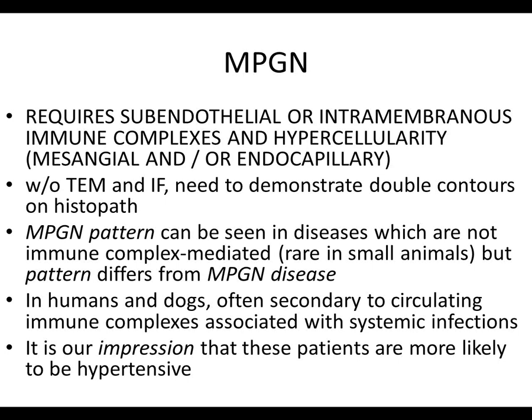And then I kind of make a comment, and I want to spend the last 2 minutes on this concept of a pattern versus a disease. Nephropathology is probably taking the same route that dermatopathology has done in the past, where we talk about patterns of disease. Usually that's a histologic pattern. So having hypercellularity, having some thickened glomerular basement membrane can actually be seen in a couple of diseases that are not mediated by immune complex deposition.